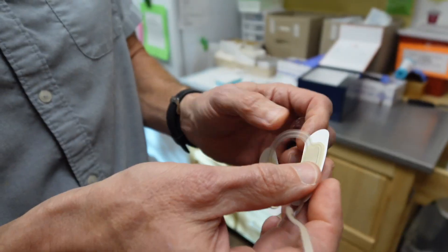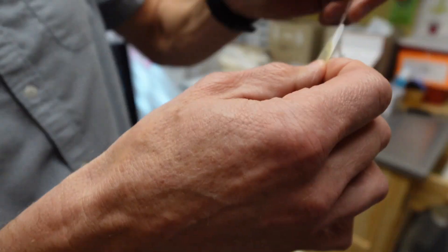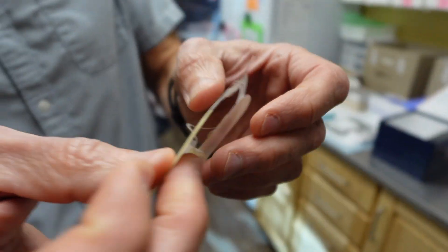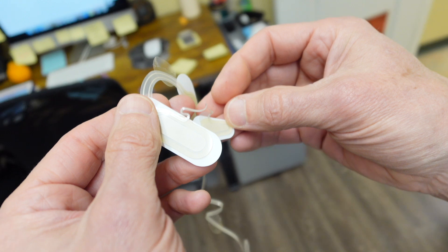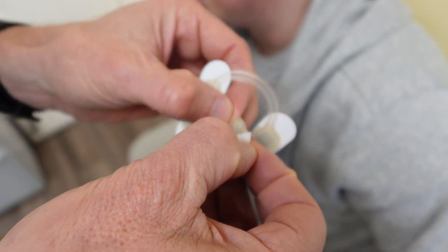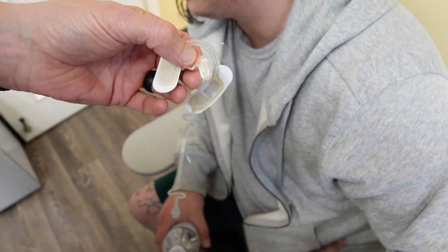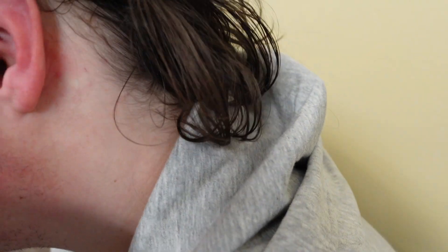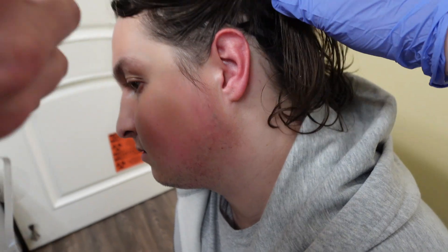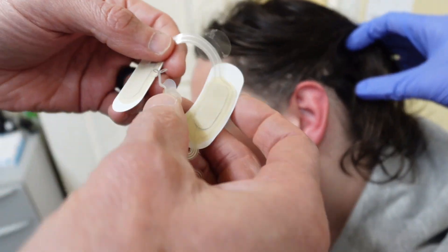The mechanism of action: this is a transcutaneous stimulator that stimulates the trigeminal and vagus nerve, increasing your brain's own endorphin and opiate supply, reducing opiate withdrawal. This is our first patient we've used it on, so I don't know how successful it is. He does give us a testimonial in another video coming out shortly. The Bridge device — they were advertising like you just needed this device and didn't need anything else. I never found that to be true. I think it helped a lot, but this is better.